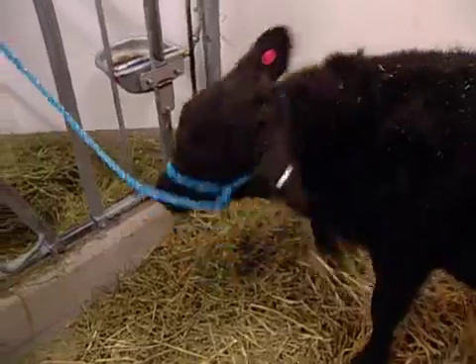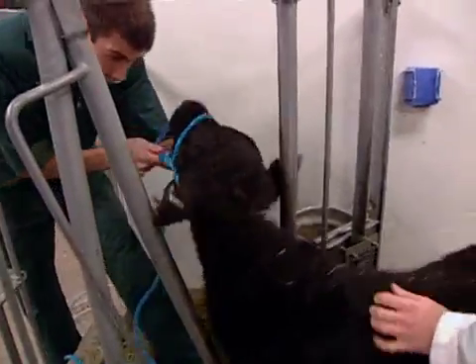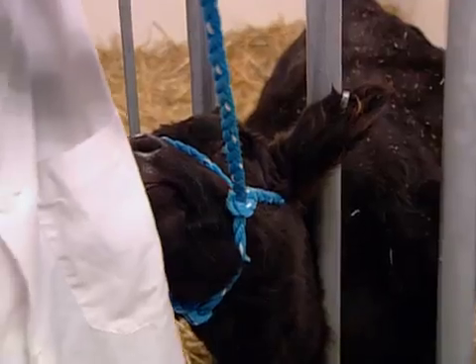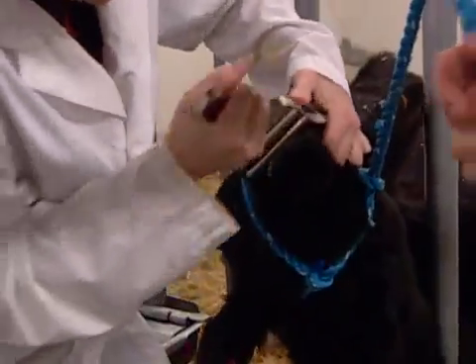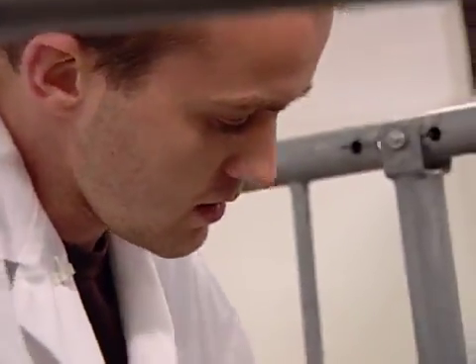This calf may be sick, but he's feisty. We've named him Poindexter. We gave him that name because he's a little bit of a nerd. He kicked one of the students when we were trying to catch him. Poindexter has a problem. He can't burp. So we'll just put the speculum into him, which might be easier said than done. Student Steve Smith attempts to put a tube into Poindexter's stomach to release gas.